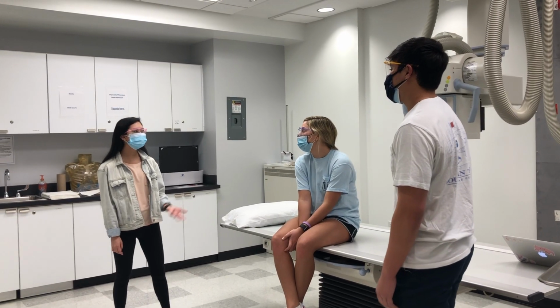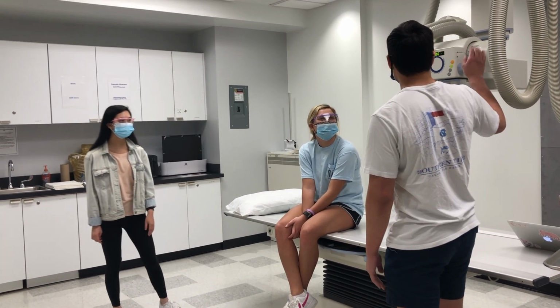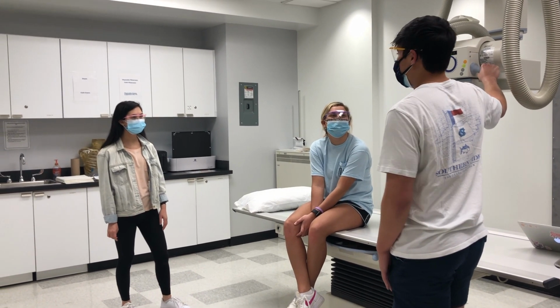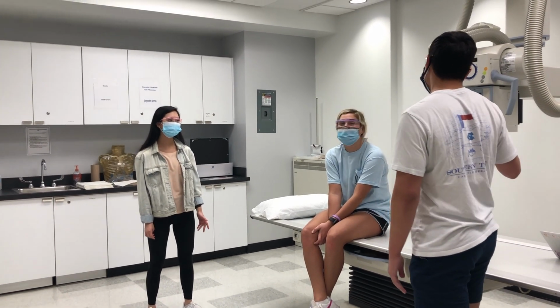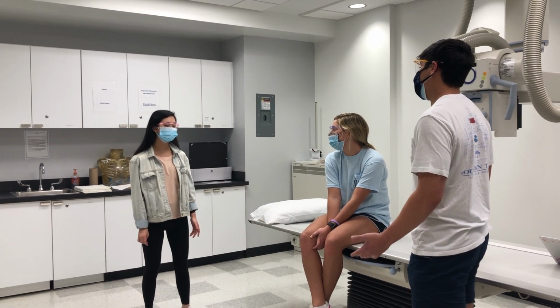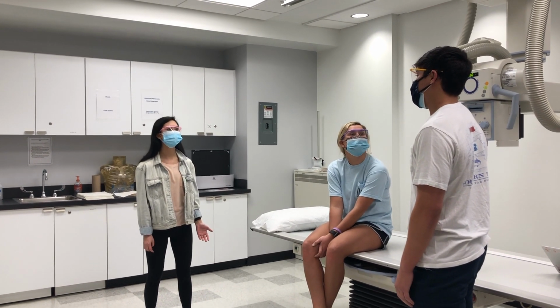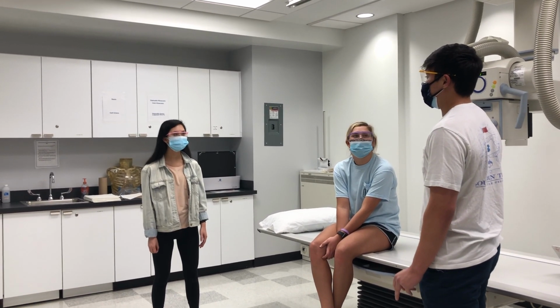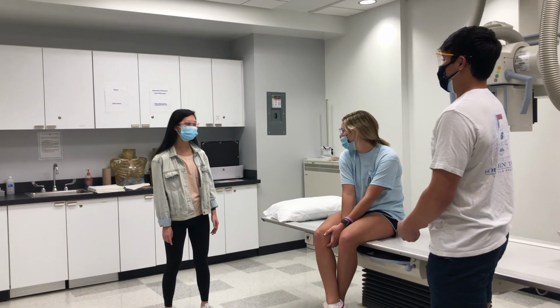So what exactly are you going to be doing to Chloe? We're going to be taking an abdomen x-ray of her today. So I'm going to be using this, my big camera right here. It's going to take a picture of your belly, okay? Okay. Do you have any other questions? Isn't that dangerous? It's an x-ray. Yeah, there's small doses of radiation, but nothing over what you normally receive from background radiation. Okay. I think that Chloe might get a little bit scared being in the room alone though. Okay, that's fine. We can give you a lead apron to put on, and you can stay in the room with her during the exam. Okay, that'll be great. Is there any chance that you're pregnant? Of course not. Chloe is enough trouble.